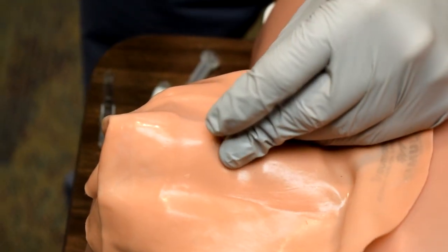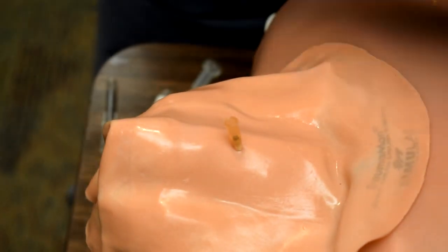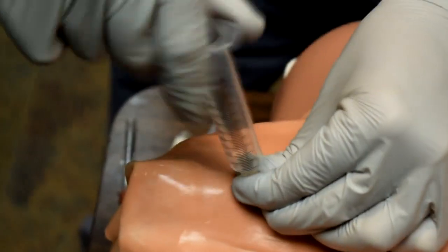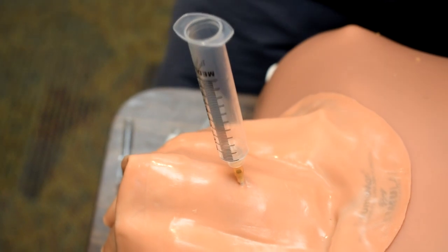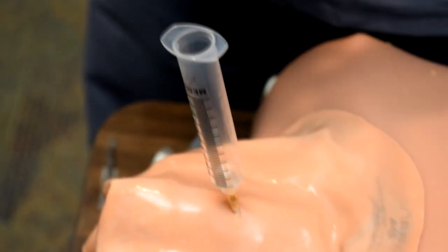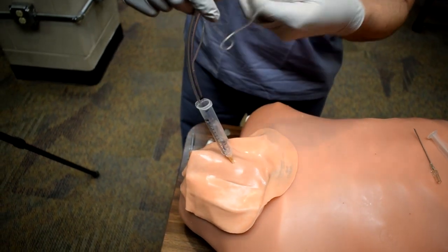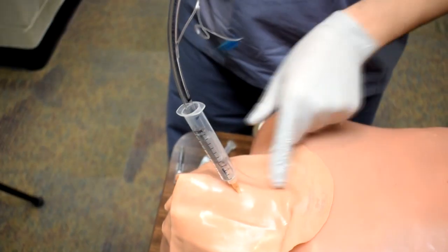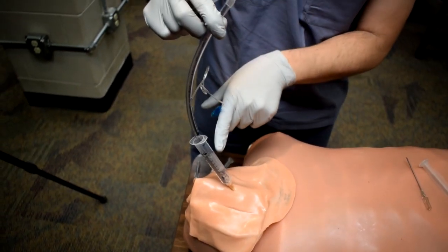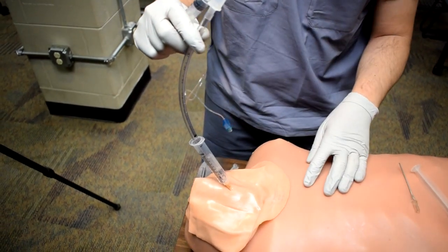and remove the needle. Then I could take the needle off, take the plunger out, and attach my syringe to the angiocath. Then I got my ET tube ready, and I'm going to insert my ET tube into the syringe, inflate the cuff, and then I have my angiocath, my syringe, my ET tube with the cuff inflated, and then I can attach the ET tube to a BVM in order to start to oxygenate the patient.